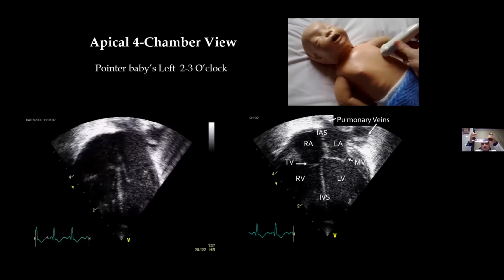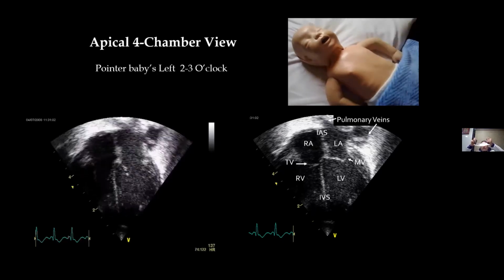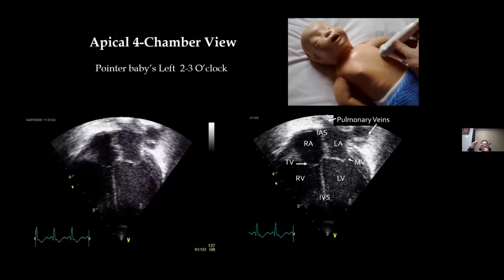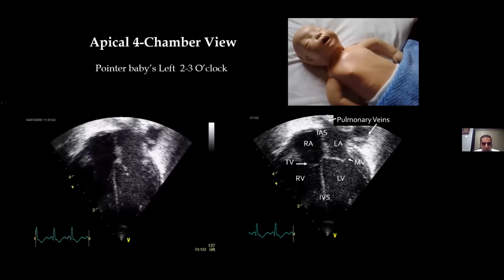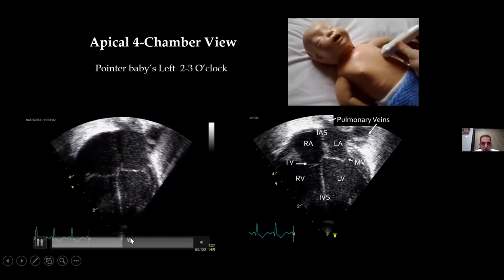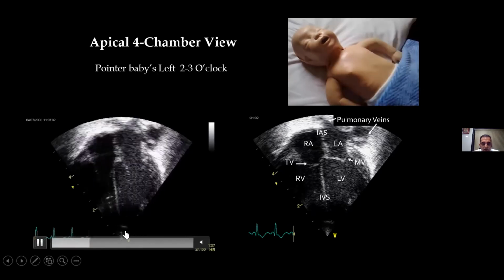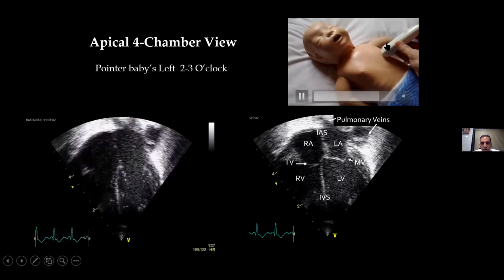Like this is the probe, and these are the beams. So it is moving in the same way where the beam is going. Okay. So I will show you how it is cutting the heart. Now you can see in this video, there is an apical 4-chamber view, and you see this pointer, the probe orientation marker. It is coinciding.